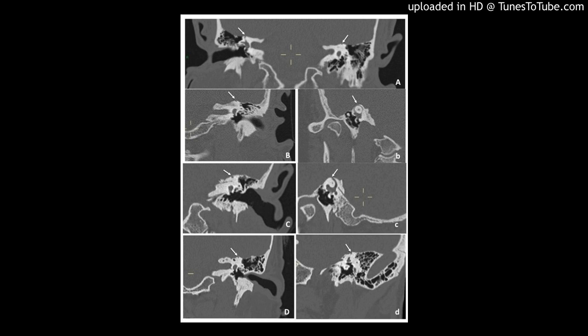Mastoid air cells are removed and the mastoid antrum is opened until the short process of the incus and the lateral semicircular canal are clearly visible, with the second genu of the facial nerve located inferior to the midpoint of the canal. The facial nerve can also be identified in the tympanon but also within the mastoid bone.